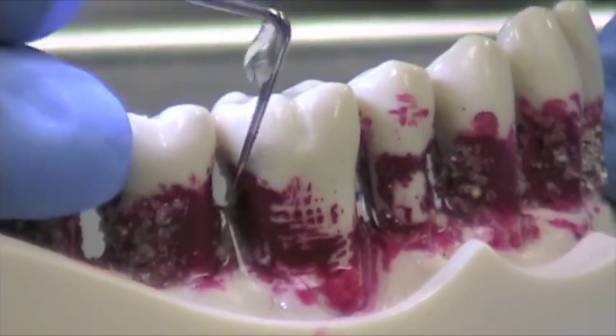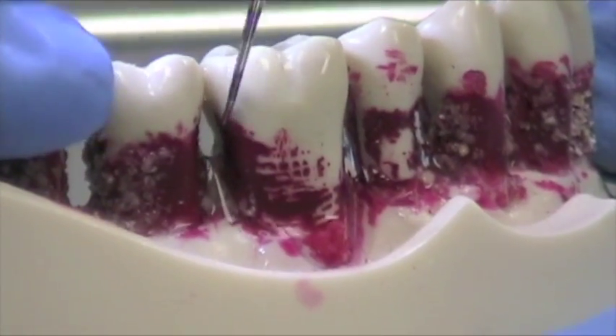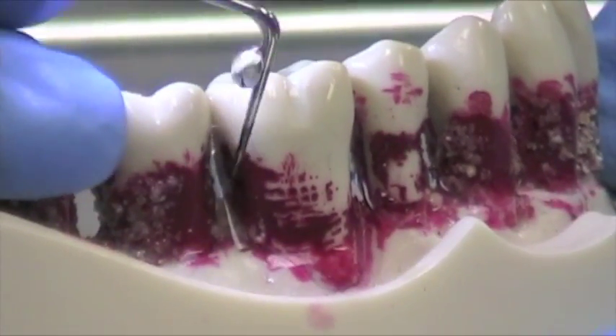This is great for pockets that are up to about 5mm. When I show you the next tip, you'll see that when pockets are deeper than that, you want to move to the next tip.